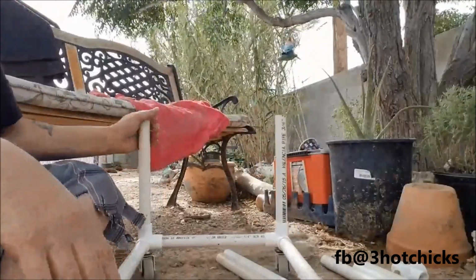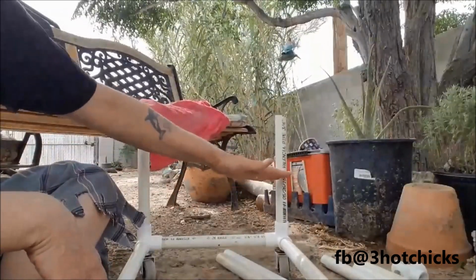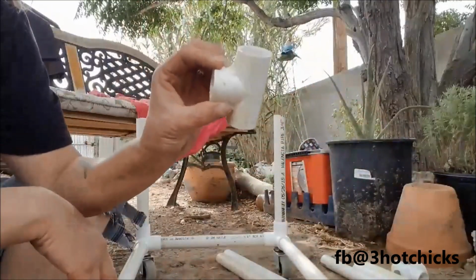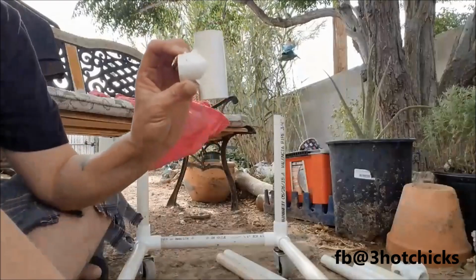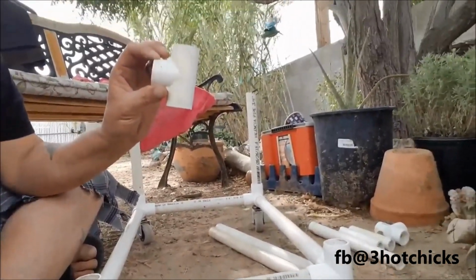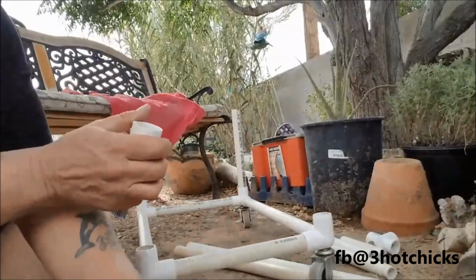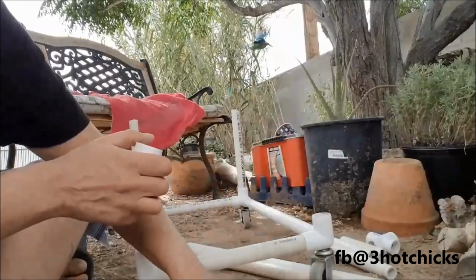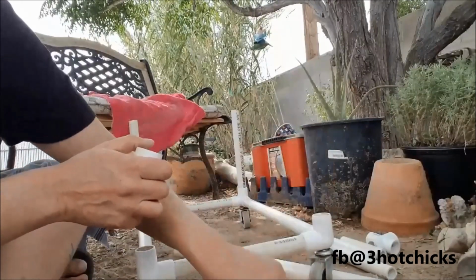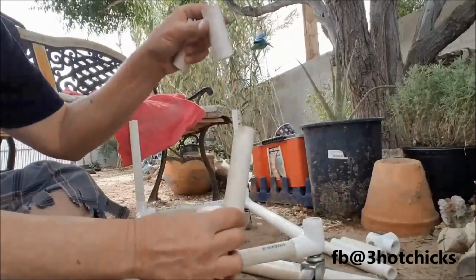And then the 2 pieces in the front, we cut these down, which you can do the same thing for the back. And we added a T-fitting. So then that way, when you put them on the front, I'm going to try to get the camera there. When you put them on the front, you can attach the bolts, and you'll see. So it goes, the small piece, we cut them in half. So this was the whole piece. And we cut them into pieces.